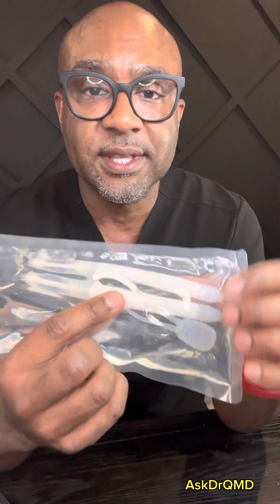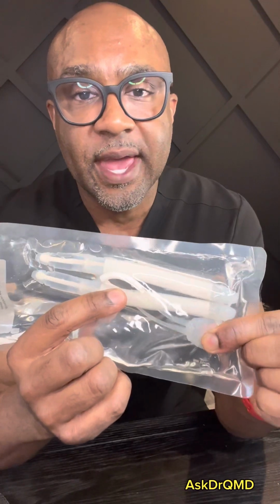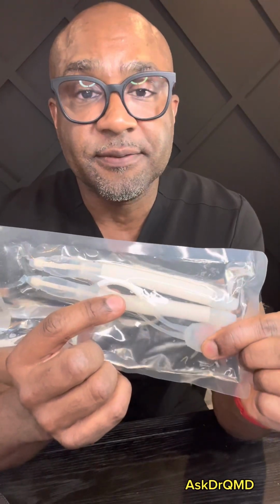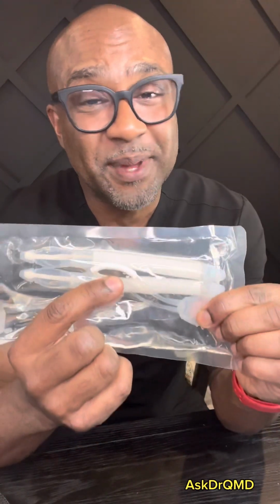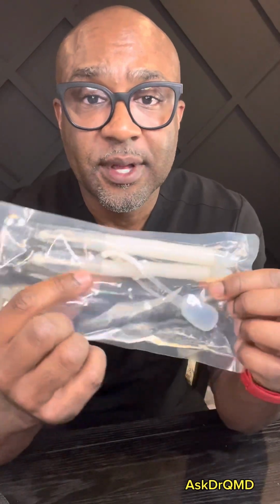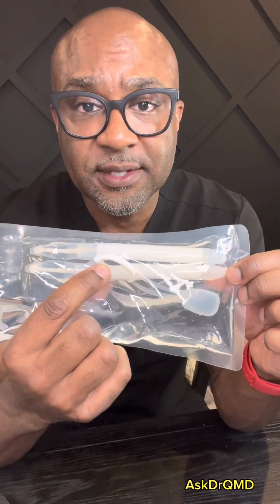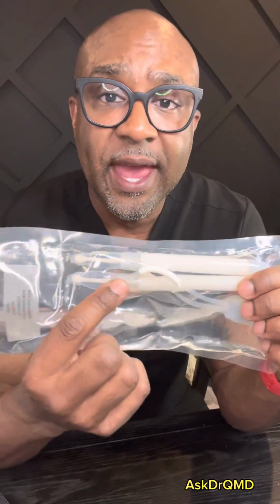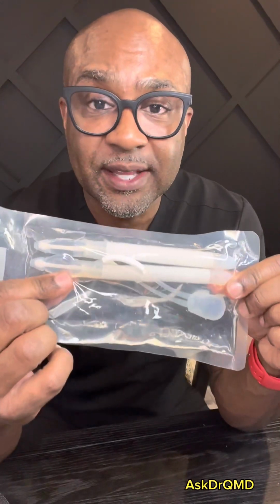Essentially, to activate this, once these cylinders go in the corporal bodies, you press this button here, and it transfers the rest of the fluid that's in here into the prosthetic. You can see it didn't take many pumps, maybe 2 pumps to get it full. And so now you have your prosthetic that is full. It's pretty rigid. The tips are harder, just like in the 3-piece, to help facilitate penetration. And you have the ability to put rear tip extenders on the back. So this is a 2-piece prosthetic.